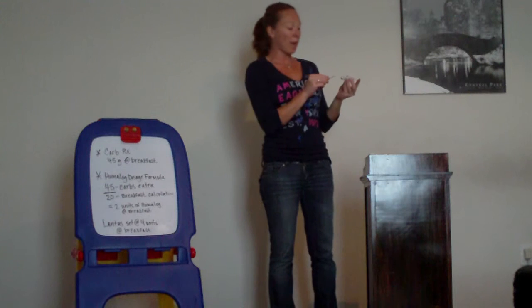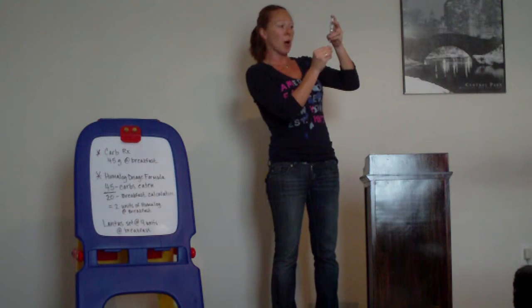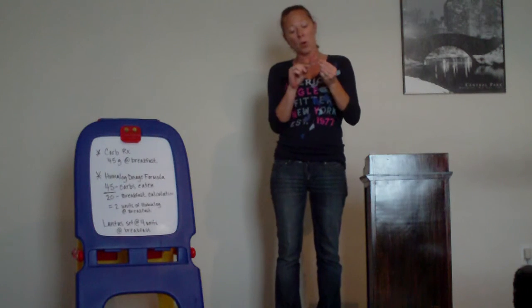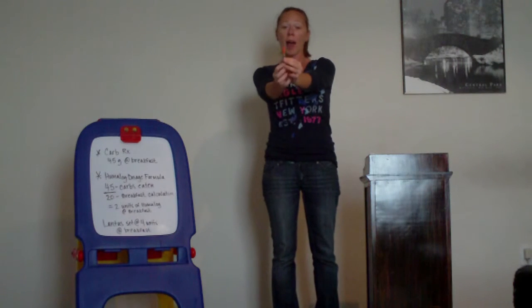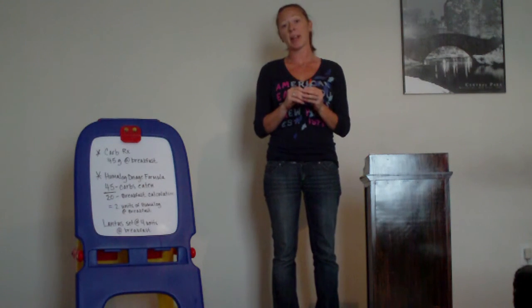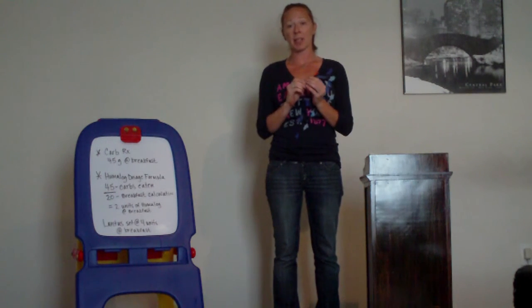After that, you grab the Lantus, insert your syringe, and draw 4 units of Lantus for a total of 6 units combined. Once you have them combined correctly, you will have a cloudy mixture of insulin. By now, you should all have a pretty good understanding of how to calculate a dosage and mix insulin.